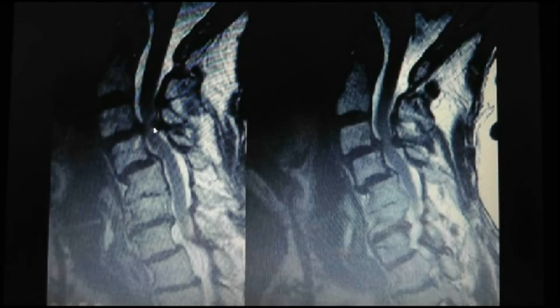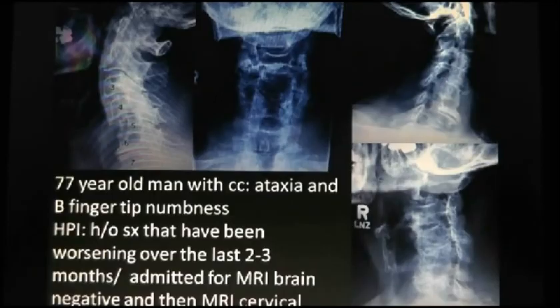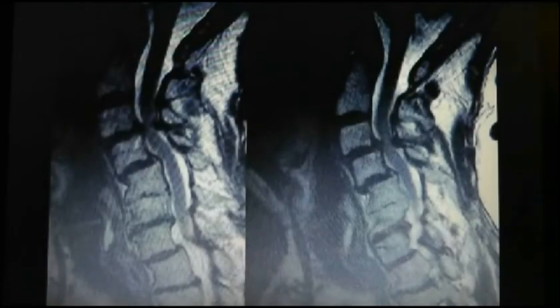There is a little bit. That looked normal on the x-ray, didn't it? A little bit of anterior listhesis at 3-4. Okay, just a little bit. But that is where his cord impingement is most severe. Yes, there's the 4-5 disease, but you can see the spinal canal is more widely patent. The lower you get, the wider it gets, generally. What is this black thing?